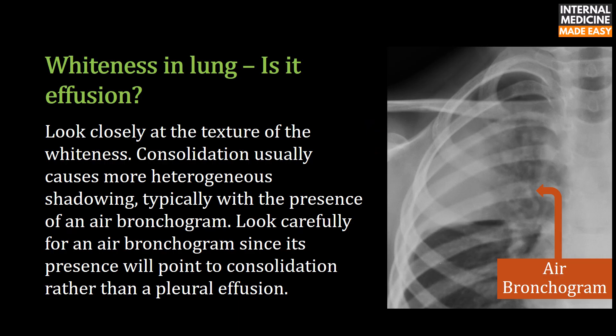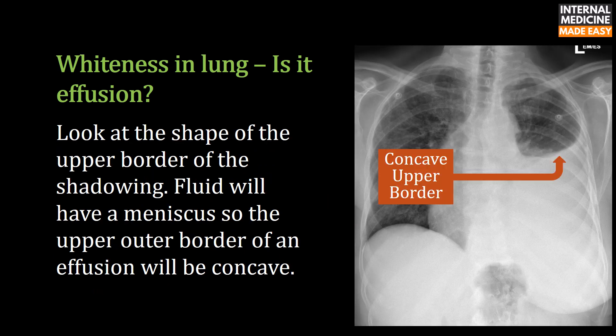When assessing whiteness in the lung — is it an effusion or not? — look closely at the texture of the whiteness. Consolidation usually causes more heterogeneous shadowing, typically with the presence of an air bronchogram. Look carefully for an air bronchogram, since its presence will point to consolidation rather than a pleural effusion. Also look at the shape of the upper border: fluid will have a meniscus, so the upper outer border of an effusion will be concave.